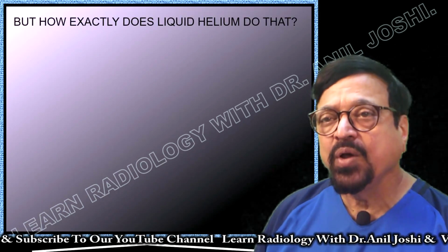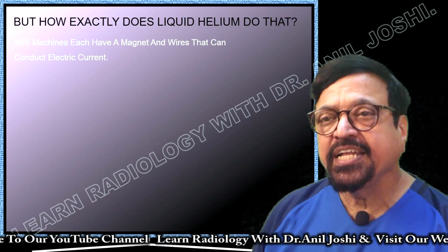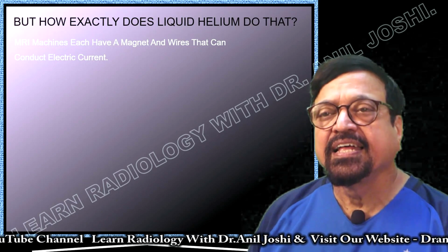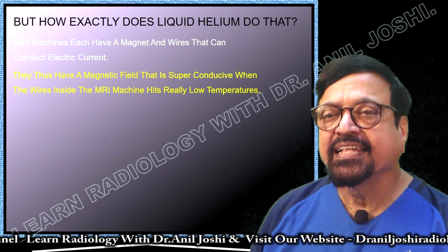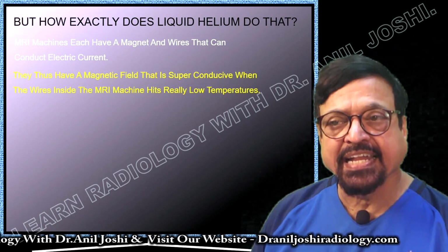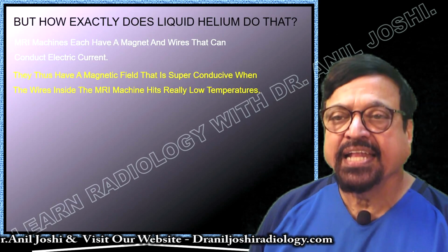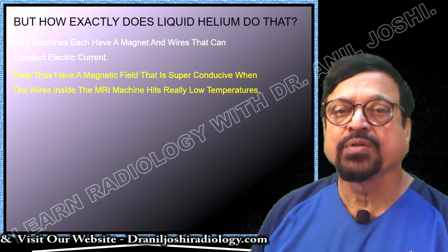But how exactly does liquid helium do that? In an MRI machine, each time a magnet and wires conduct electric current, they have a magnetic field. So because electricity is applied, there is a magnetic field, and superconductivity occurs when the wires inside the MRI machines reach really low temperature.